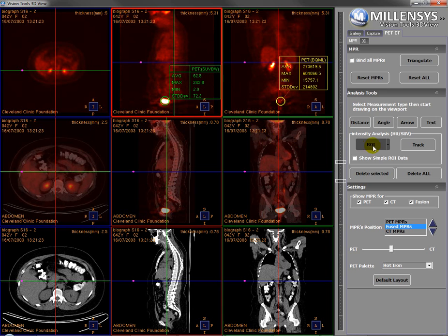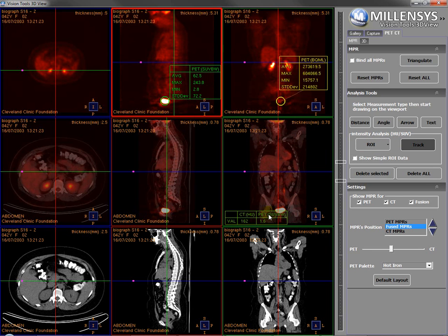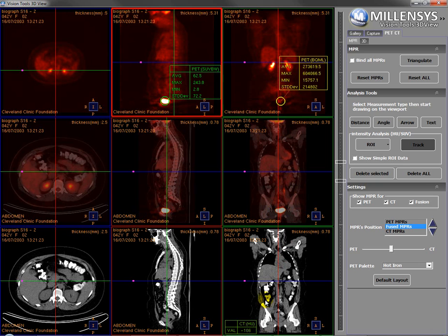I can also track a single pixel — not a complete region of interest — by moving the mouse over that region. I have here the CT and the PET measurement in that region. When I move to the PET, I have the PET measurement; when I move to the CT, I have the CT number of that point. That's the pixel tracking feature.